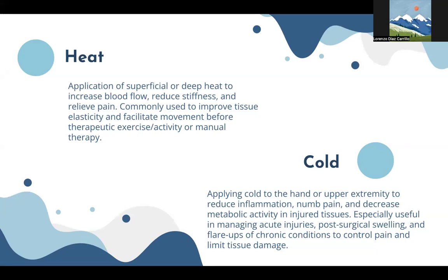But I will say that when it's an evaluation day, or you're reassessing the patient on their measurements like goniometer or grip strength, it's best to do this afterwards, because you don't want heat to affect the results and your charting when it comes to watching their progress. If you apply heat, most of the time you'll see improved range of motion. So you want to get the assessment values based on how they come in to you that day. Just a little caveat there.